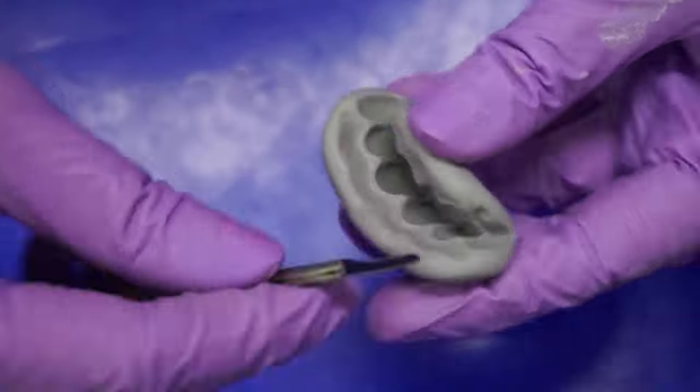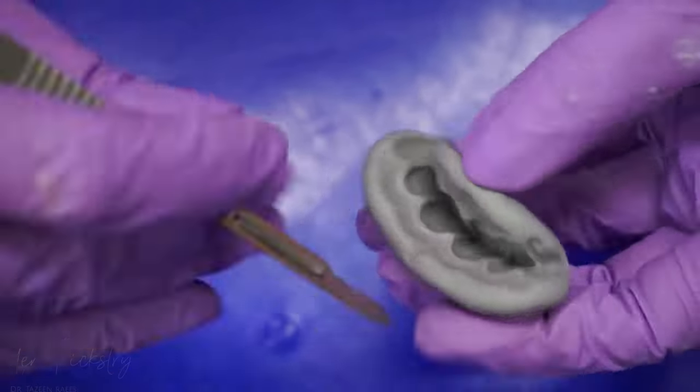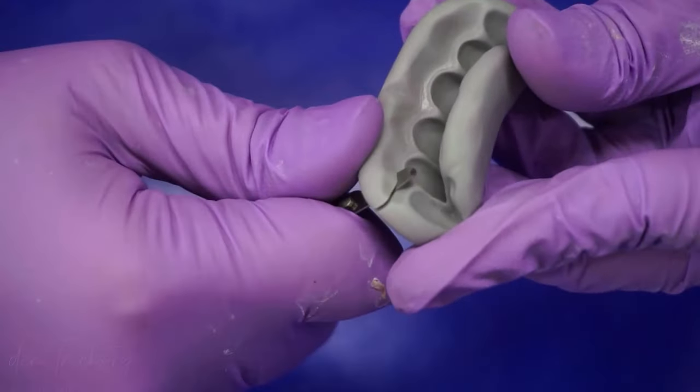Once the index is done, I prefer cutting off the excess from the labial and palatal surfaces till the cervical margin of the teeth.